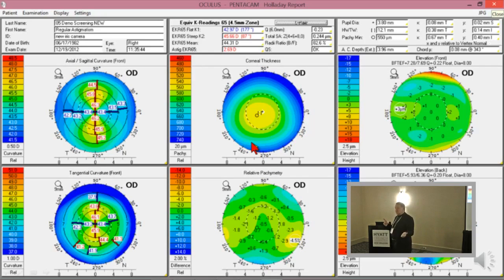And every single intraocular lens formula, from the Holladay to the Binkhorst to the Hoffer Q to every single formula out there today, the first step is to convert that from a K reading to true net power. Okay, now we argue a little bit about what the net index of refraction that you should use, so we don't all get the same answer, but it's within 1/4 of a diopter of 1 diopter less than the K reading every time you do it, okay? So Hoffer Q may make it 44.12 for a 45. Holladay 2 may make it 43.8, but I'm saying all of those reduce it by 1 diopter plus or minus about 1/4. That's the difference between the formulas.